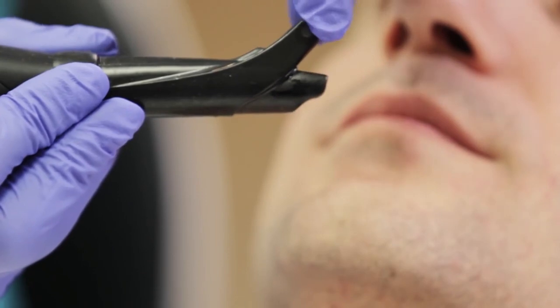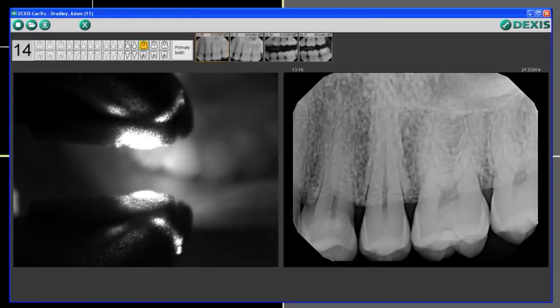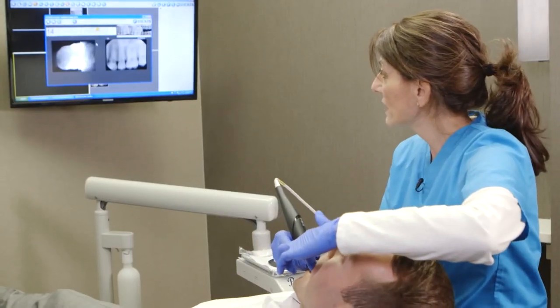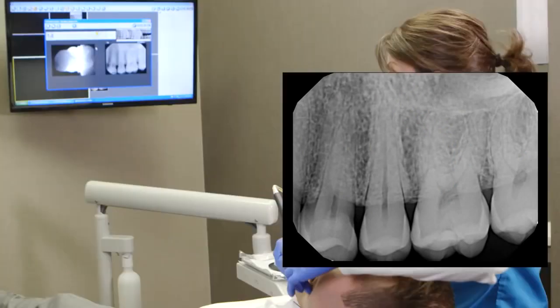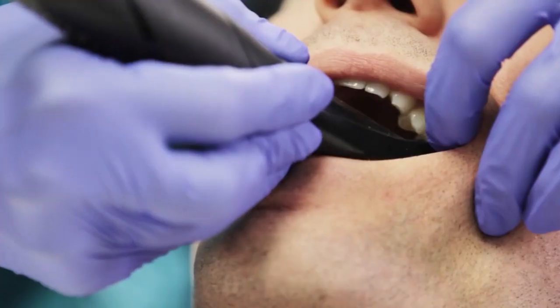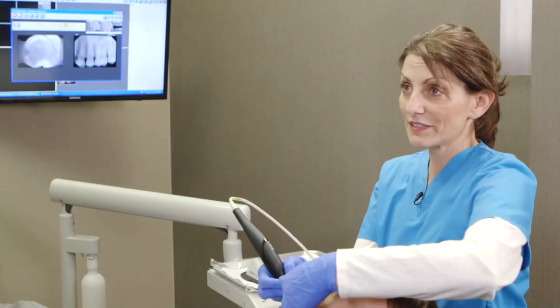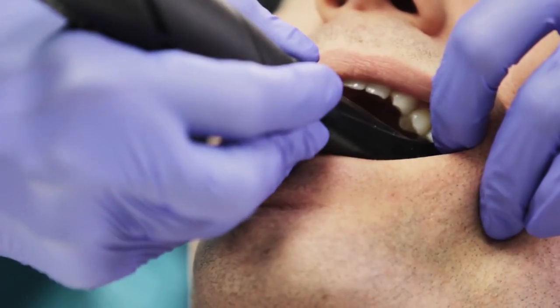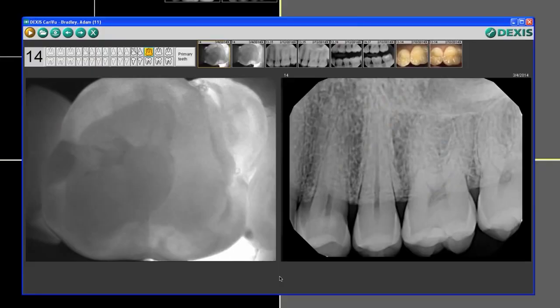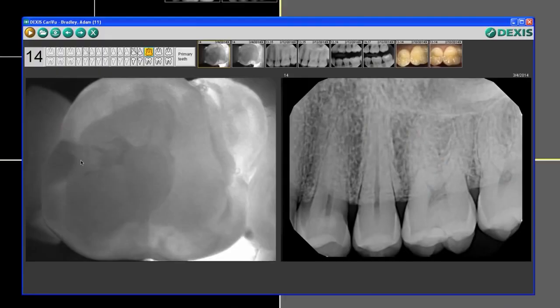To capture the image I'm going to cradle the tooth within these two arms at the gingiva. You can see on my screen that it looks quite white — that could be an indication that my device is not fully seated at the gingiva, so I'm going to push it down just a little bit more. Opposite, if it's too dark I need to pull away a little from the gingiva. As I push it down to the gingiva you can see that in fact there is darkness towards the distal of that tooth, which is an indication of the near-infrared light not passing through — indicating caries.